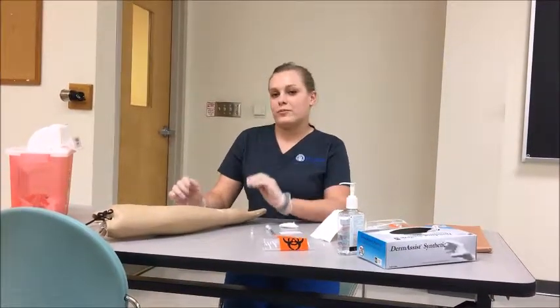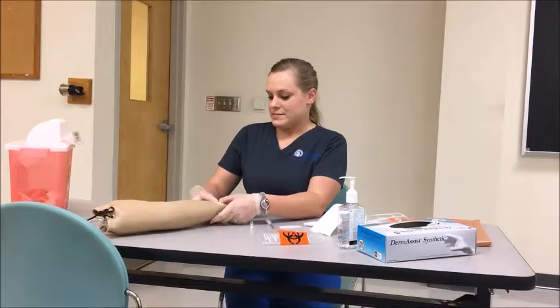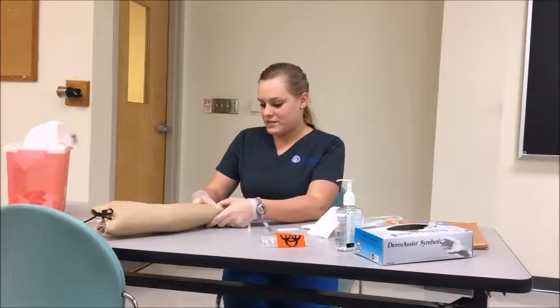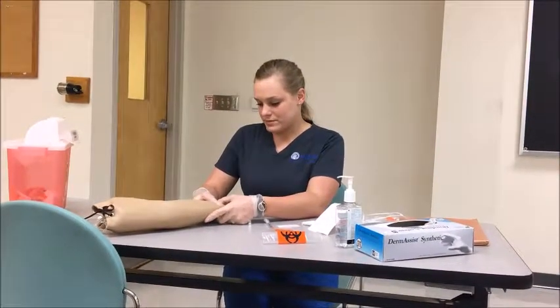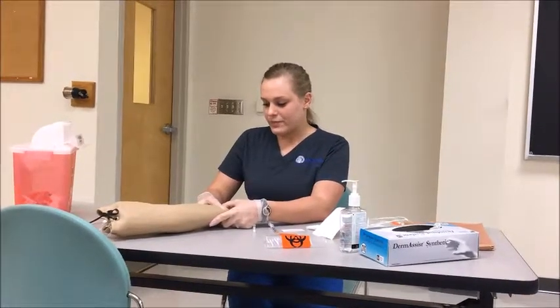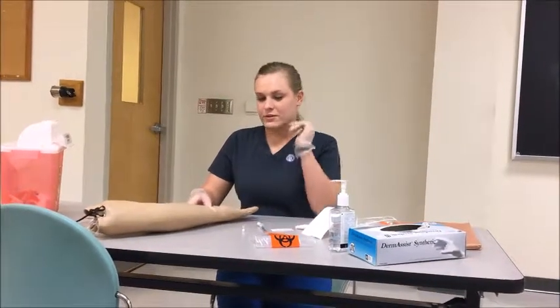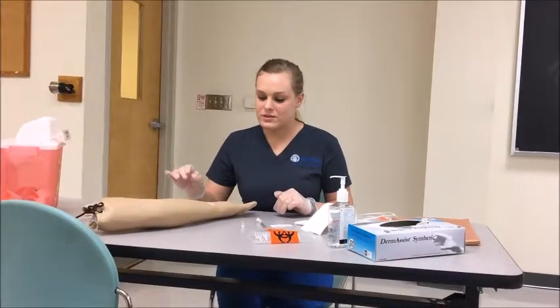Before I perform this test, I'll be doing the modified Allen's test to make sure the patient has good collateral circulation. You can just squeeze your fist three times and then hold. And then let go. Their hand pinked up in less than 10 seconds, so they have a positive result. So we can use the radial site.